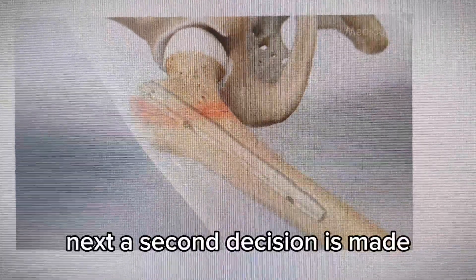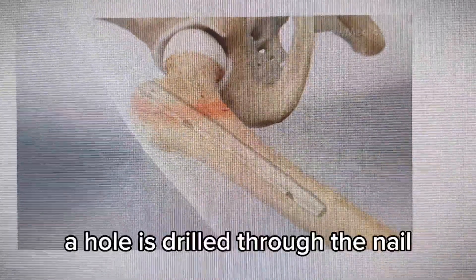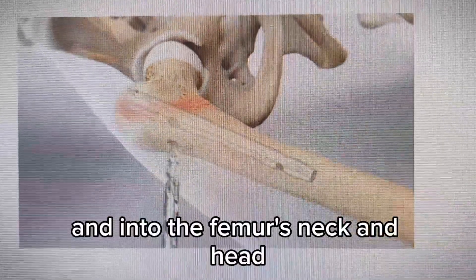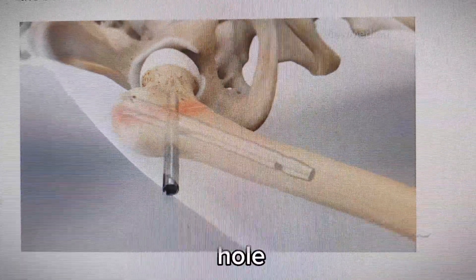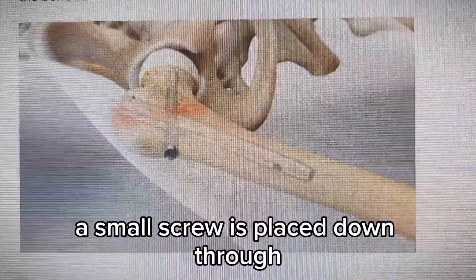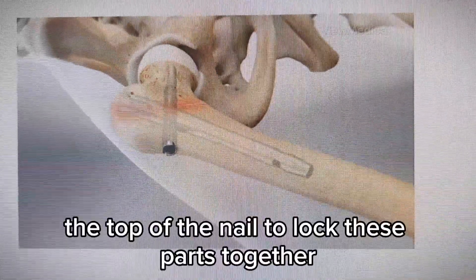Next, a second incision is made. A hole is drilled through the nail and into the femur's neck and head. A long screw is threaded into this hole. A small screw is placed down through the top of the nail to lock these parts together.